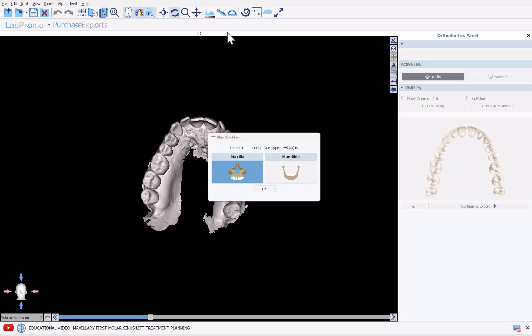The software presents a model on screen. Select the relevant jaw type and click OK.